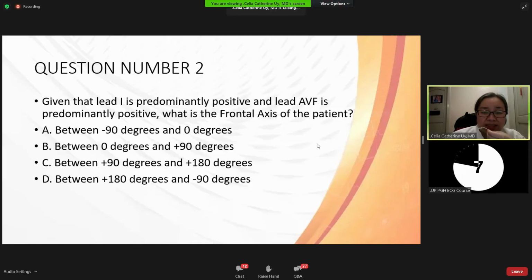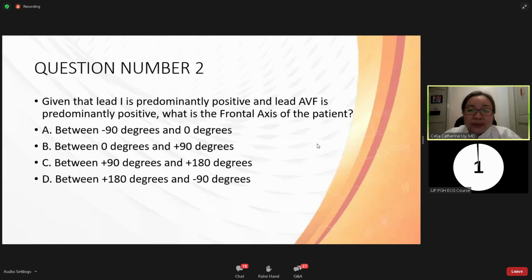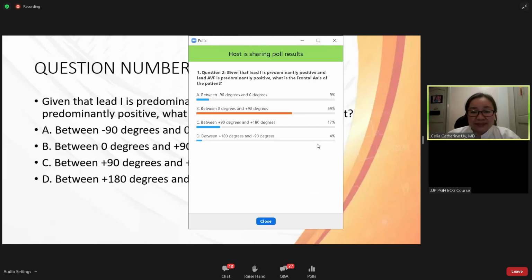So 8 seconds to go. All right. Again, the majority of you answered, 69% of the group answered letter B, between 0 degrees and positive 90 degrees.